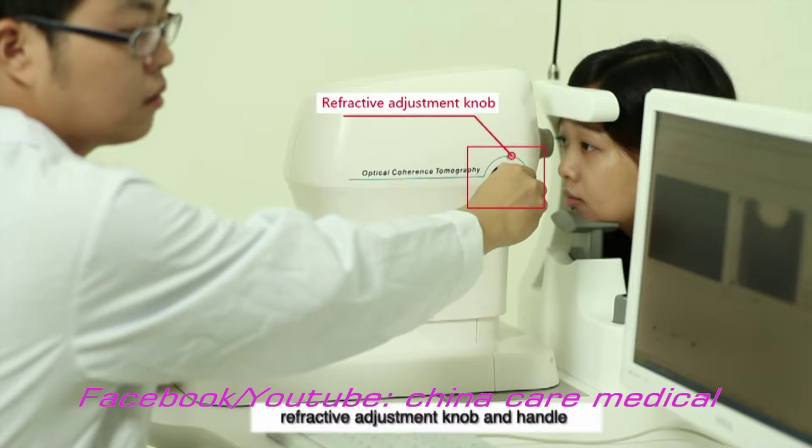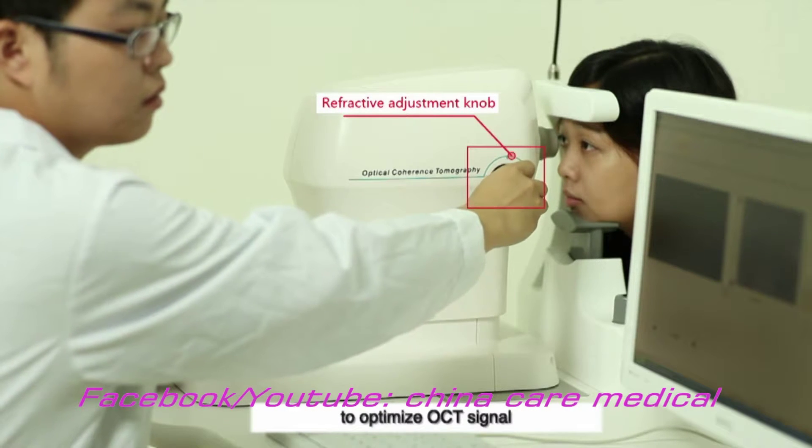Step 3: Find and adjust refractive adjustment knob and handle to optimize OCT signal.